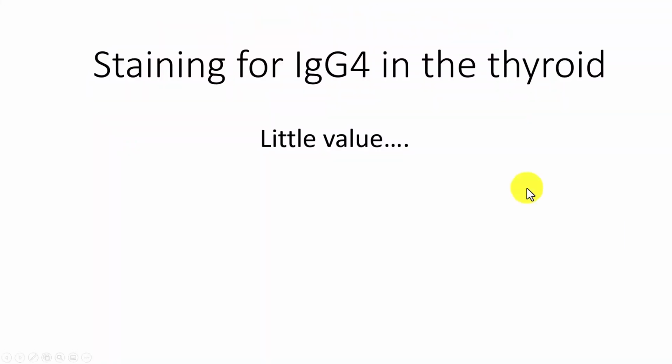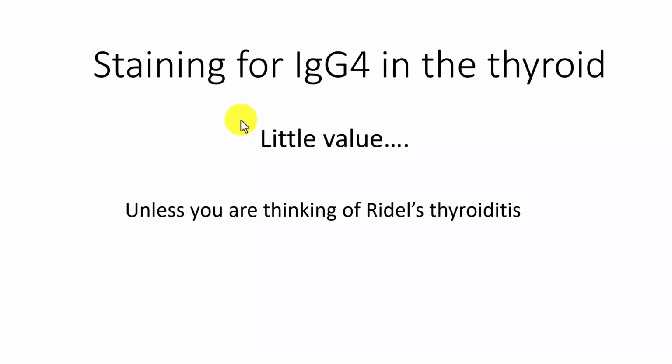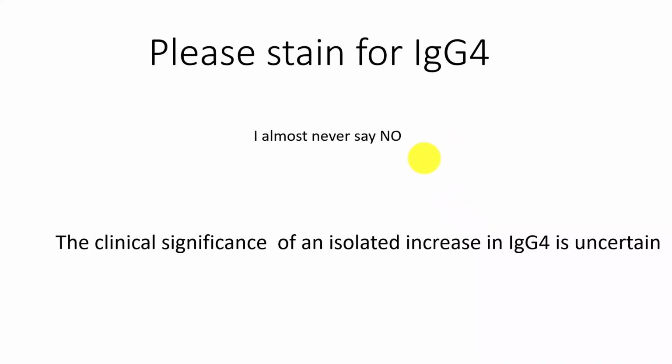So here's the question for you. You walk in on a Monday morning, and somebody asks you, oh God forbid, on a Friday evening, can you stain this for IgG4? And really, it has very little value unless you're thinking of Riedel's thyroiditis. So you're within your rights to tell him or her that, look, this is not going to help you one way or the other. That said, when people ask me to stain for IgG4, I almost never say no, but I add that note in that the clinical significance is totally uncertain.